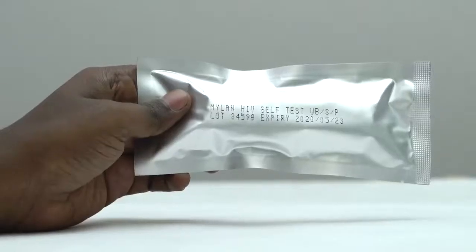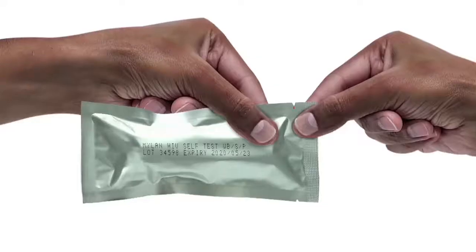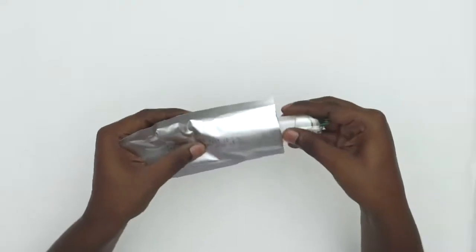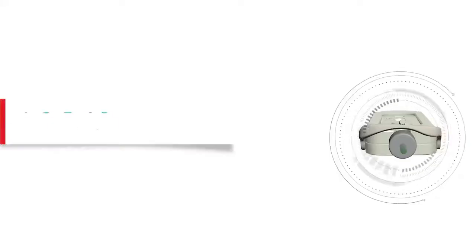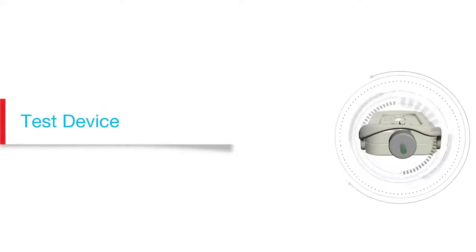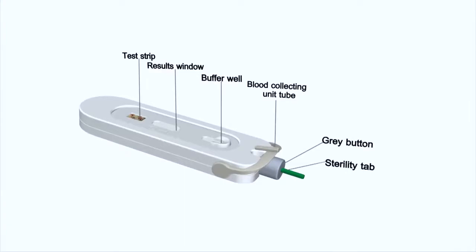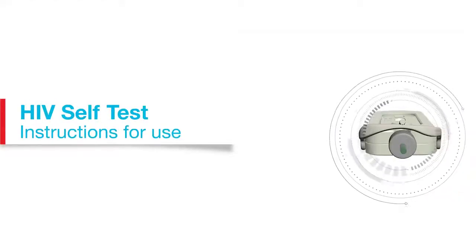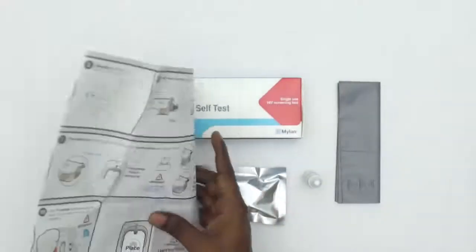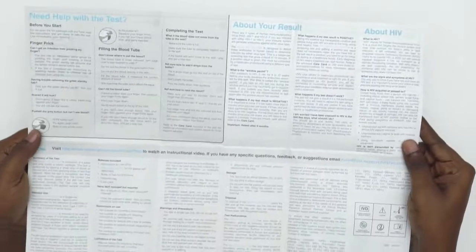Before you open the foil pouch, check the expiration date to make sure it is still current. Open the foil pouch using the tear notch and take out the test. Don't use the test if the foil pouch is damaged. Mylan HIV self-test is an internationally acclaimed device known for its innovative design, performance and ease of use. Before you start the test, unfold the instructions and read them carefully to get familiar with the testing process.